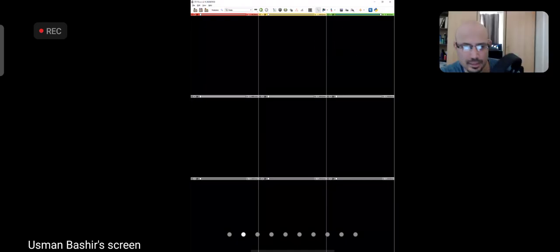Yeah, it does this sometimes. That's what I don't like about this software. Crashes and does stupid things. Sorry, I'm just going to load it again. It should take no more than a minute.